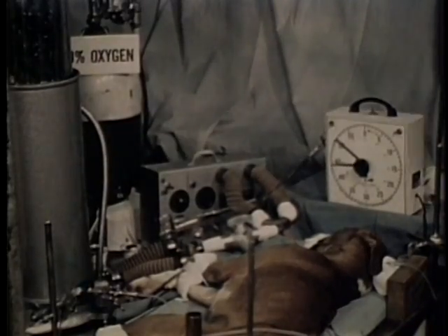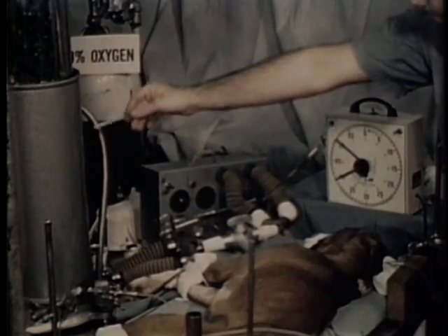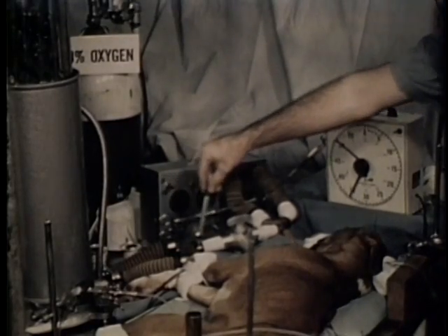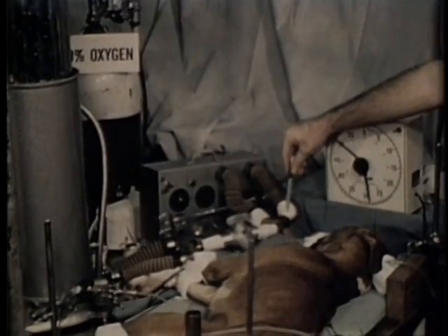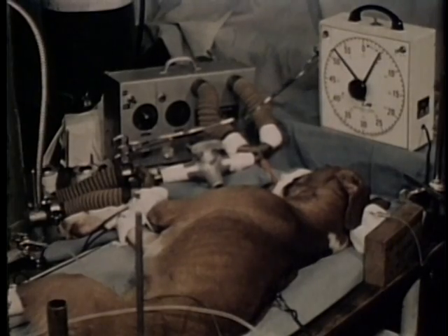The source of oxygen for the animal is now the spirometer, and the circuit for this oxygen flow is indicated from the bell through the stopcock, which has been repositioned, and into the endotracheal tube, completely bypassing the ventilator. The animal is now being kept alive through the process of apneic oxygenation. We will now explain this process in the following diagrams.